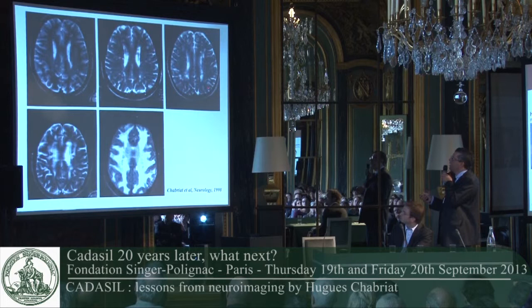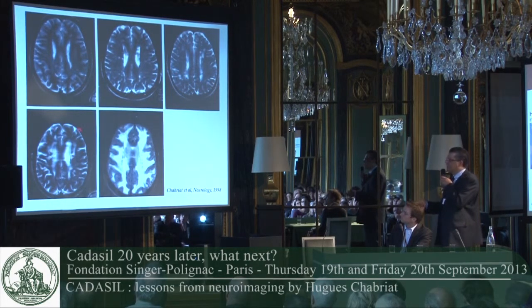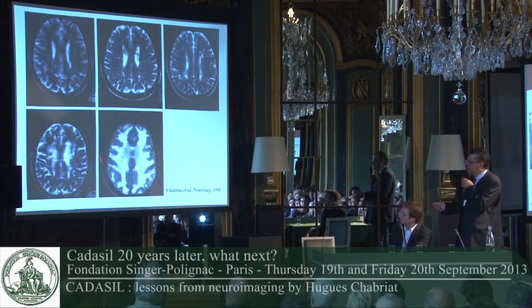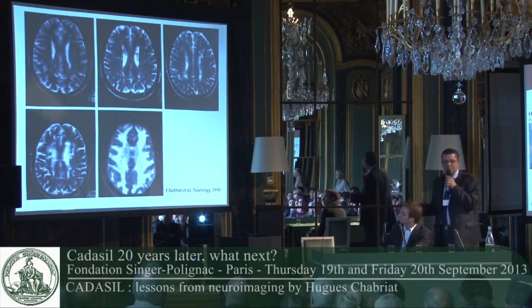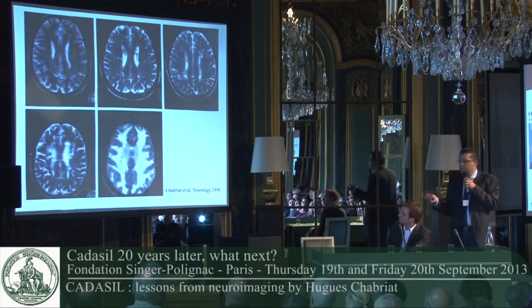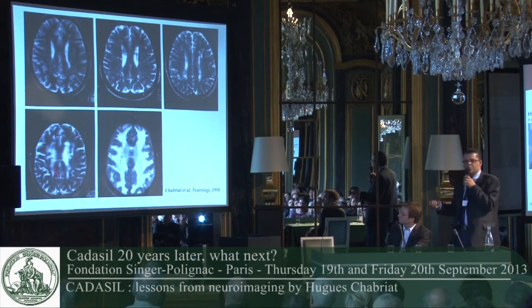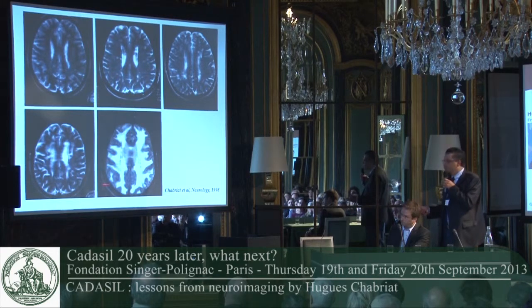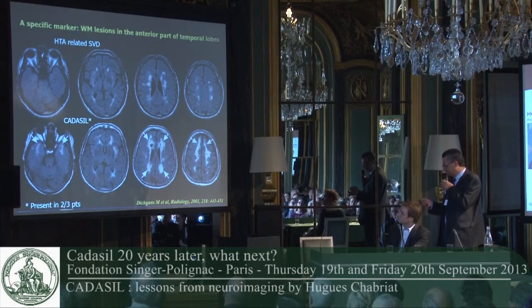This other had a stroke and was 40 years of age. This one, 50 years of age with some cognitive impairment. And this one was a patient from Lille. And she presented with a history of cognitive impairment without any stroke. And the diagnosis was unknown at this time. All these patients have CADASIL, and you can see here the potential progression of white matter hyperintensities.